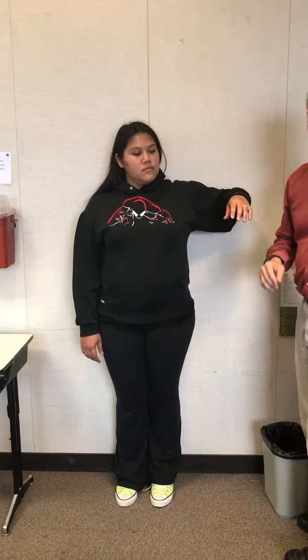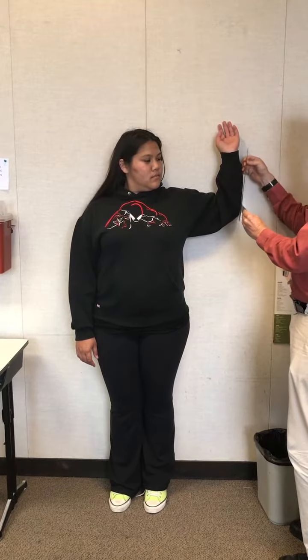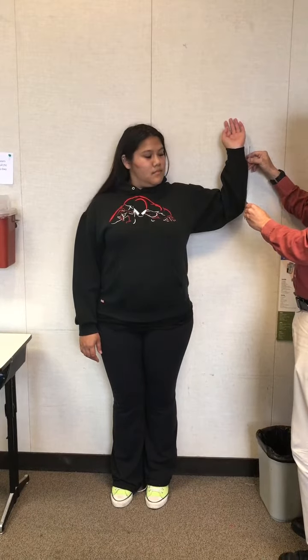Take the goniometer and put it against the elbow, the center of it. Now raise up that way. What do you think — external or internal rotation? External rotation, right.